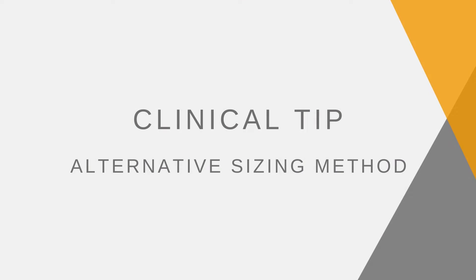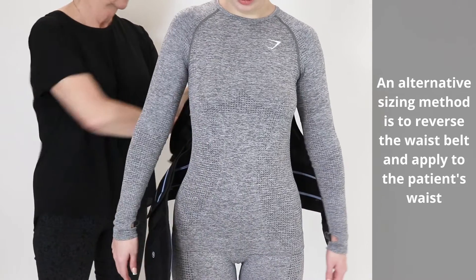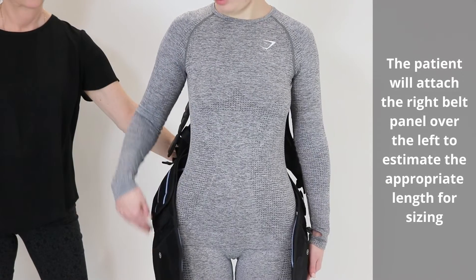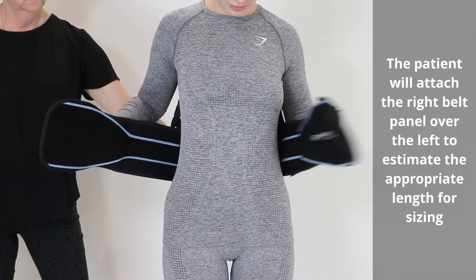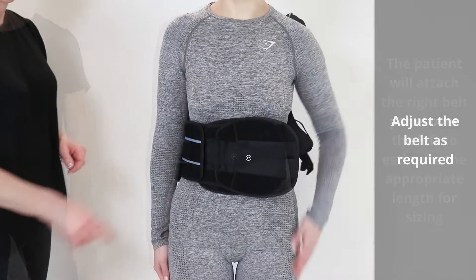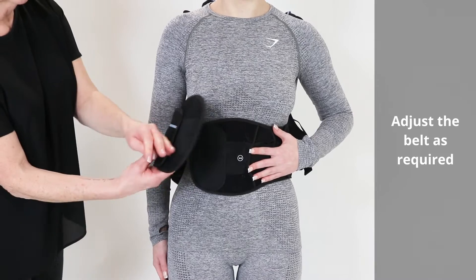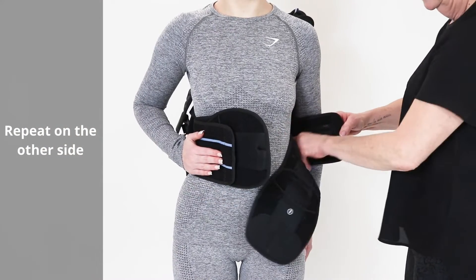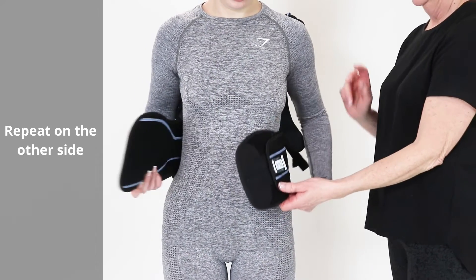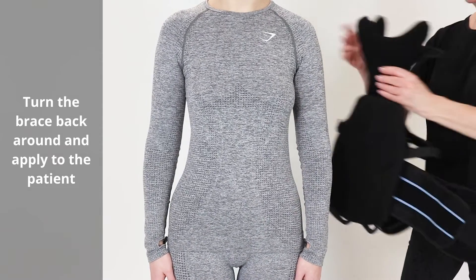Clinical tip: An alternative sizing method is to reverse the waist belt and apply it to the patient's waist. The patient will attach the right belt panel over the left to estimate the appropriate length for sizing. Adjust the belt as required. Repeat on the other side. Turn the brace back around and apply to the patient.